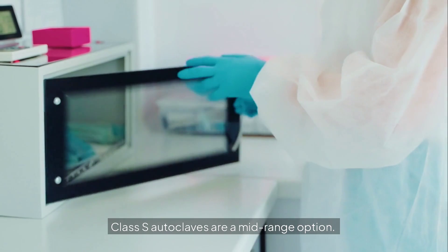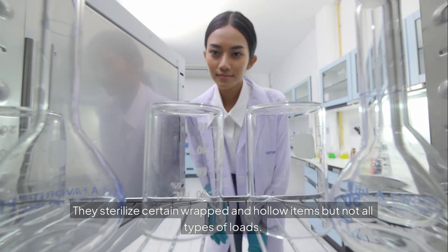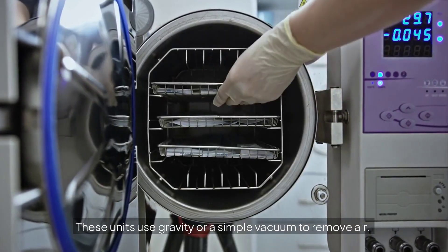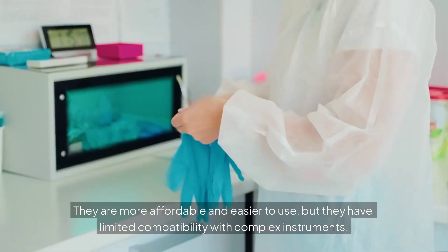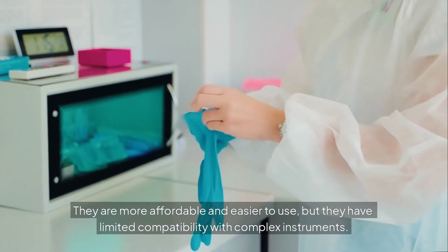Class S autoclaves are a mid-range option. They sterilize certain wrapped and hollow items, but not all types of loads. These units use gravity or a simple vacuum to remove air. They are more affordable and easier to use, but have limited compatibility with complex instruments.